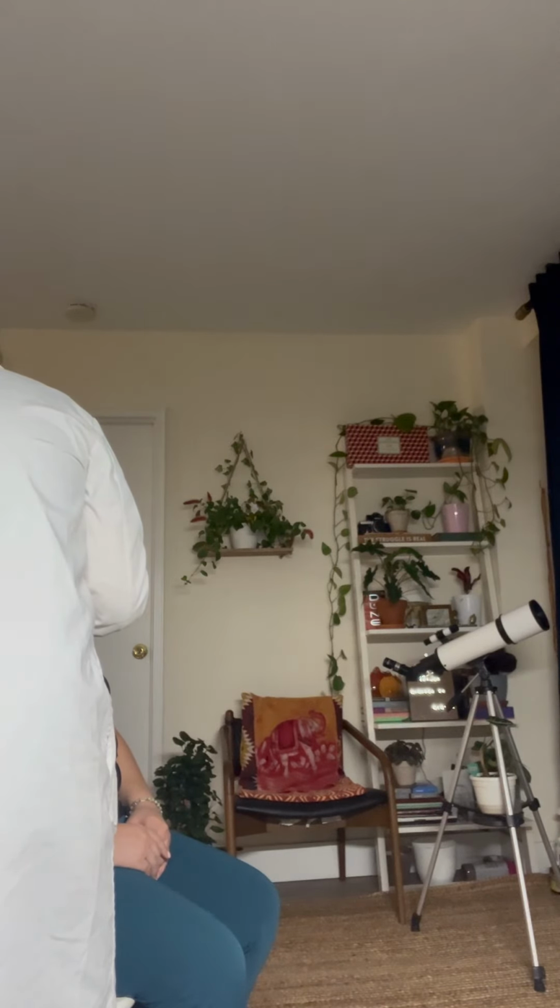Okay, tympanic membrane is visualized. It's pearly gray, intact, no perforation, no scarring, bleeding, or drainage. Minimal cerumen noted. No masses, no lesions present. Cone of light at 4 p.m. Malleus and pars flaccida intact and noted. I'm going to be doing the same in your left ear.